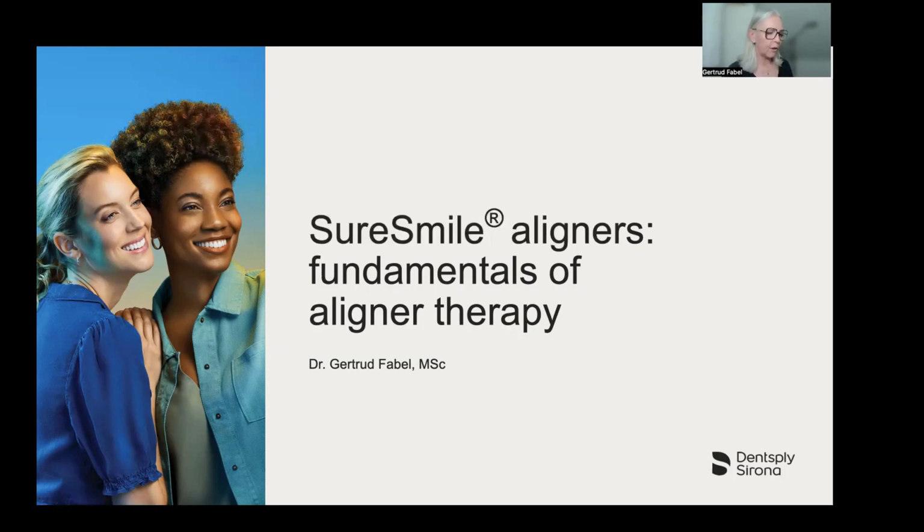Approximately 60% of all adults have crowded teeth in one or both arches, which can cause not only aesthetic concerns, but also periodontal problems and difficulties in prosthetic planning. Aligner therapy has become increasingly popular thanks to its ability to treat not only easy to moderate cases, but also improve speech, chewing and swallowing, and potentially alleviate issues such as CMD or obstructive sleep apnea.